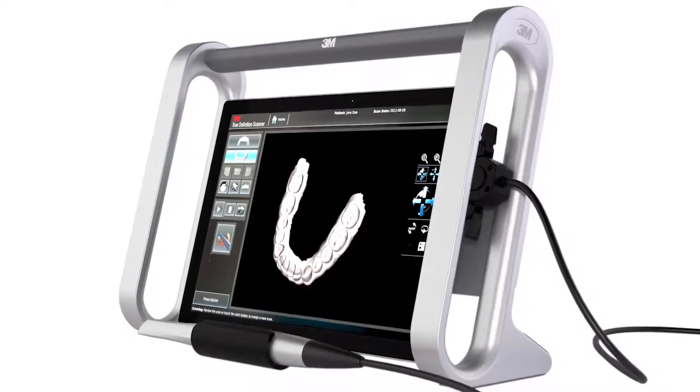We can pick it up and take it from operatory to operatory so we don't have to have multiple scanners. I've actually even taken this to a football practice field for a local university to scan their football players in the middle of practice to have mouth guards made. Defensive backs would come off the field, I'd scan them quickly — they'd be out for literally three plays and then back in practicing. The portability is really great. You can move this to a hygiene room or any operatory. It comes with a really nice hardy stand so it holds up well and would be very difficult to drop.